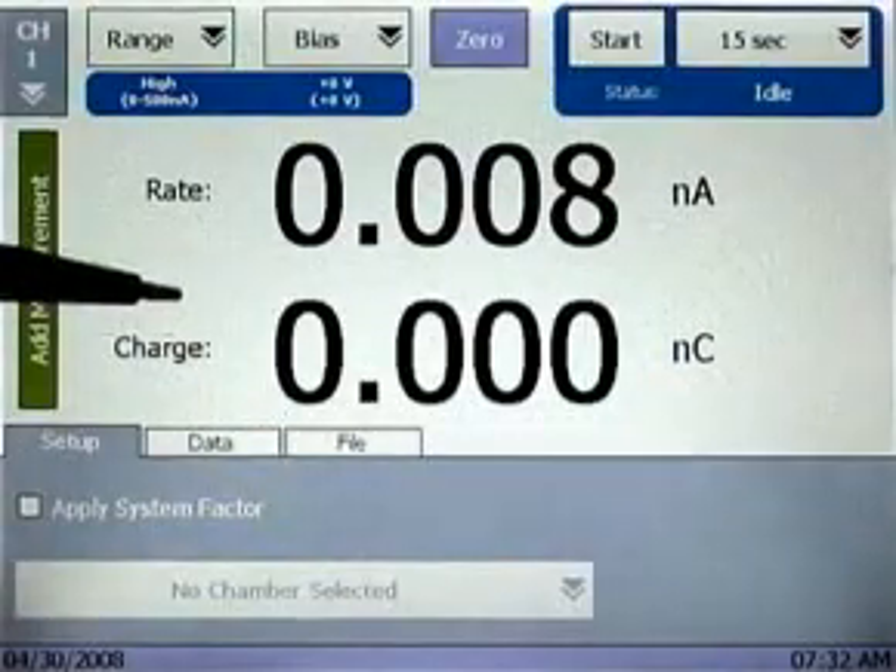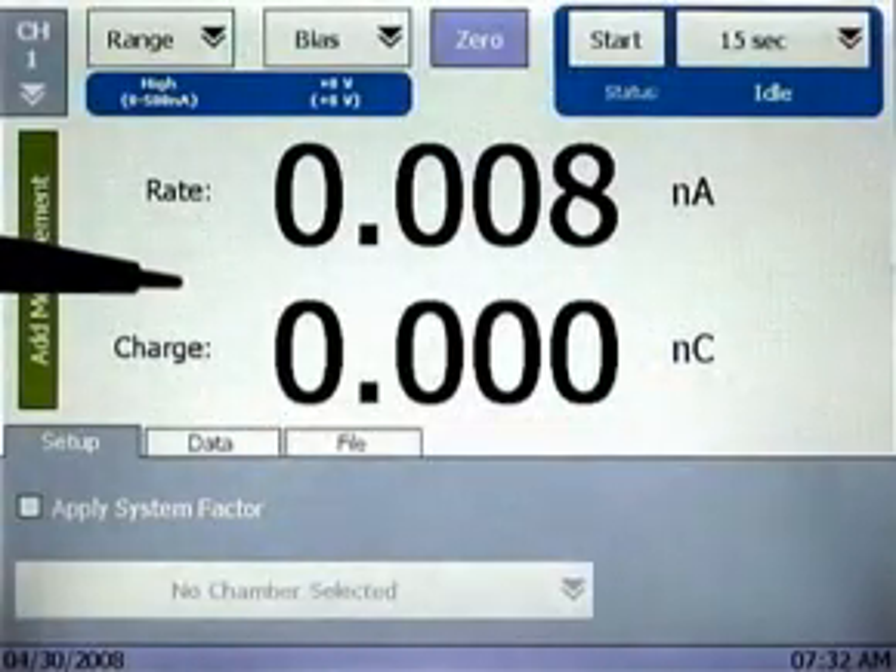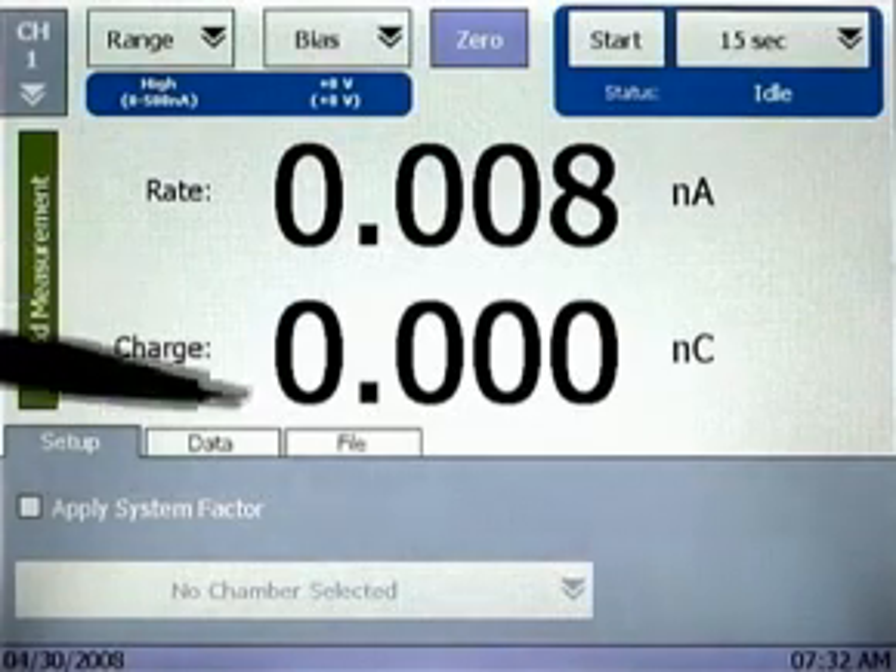This is the measurement interface. All functions are controlled by the touch screen, which can be operated by using the included stylus or your fingertip.